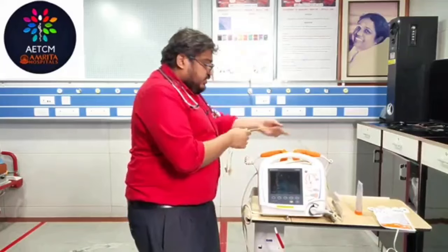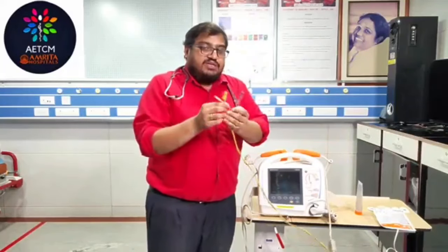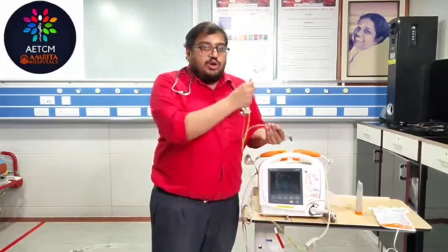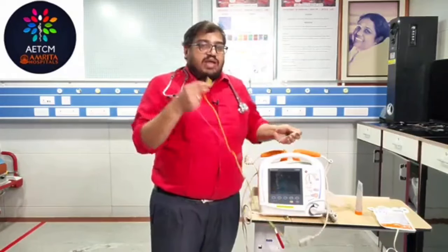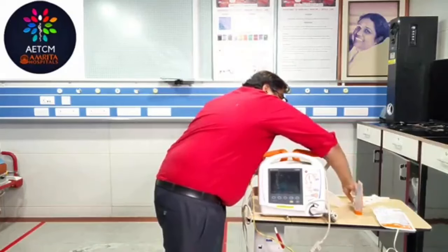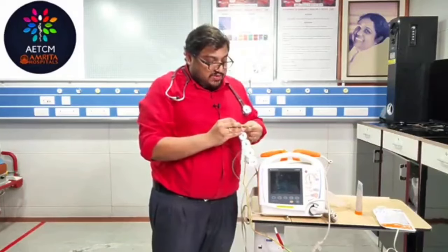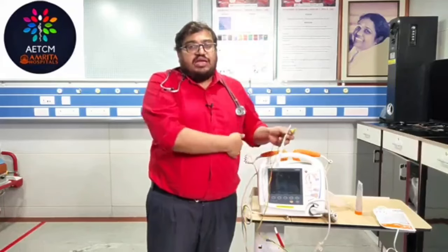Next thing is that you will be having cables like this, 3 cables. So red to the right shoulder, yellow to the left shoulder, and green to your apex. So this is the placement of your leads, and you should be having your electrodes like this. These are the electrodes that are available. You need to fix these over the patient's bare chest. So red over your right shoulder, yellow over your left shoulder, and green over your apex.